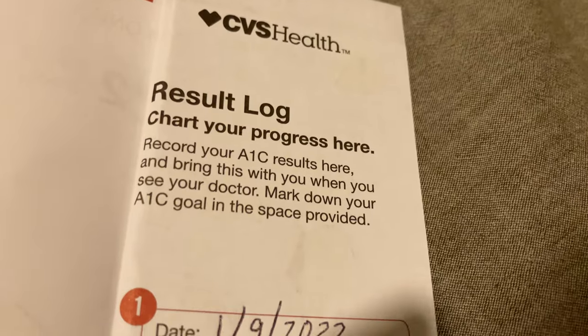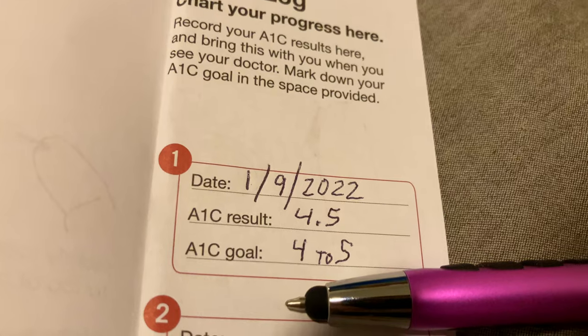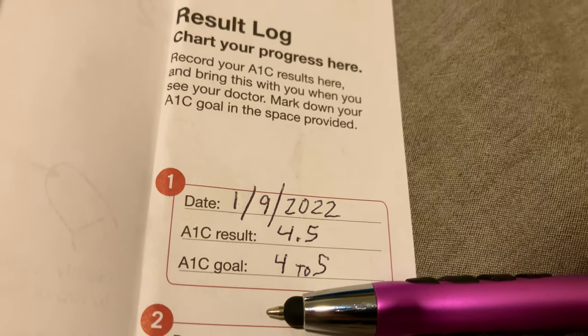Now, bonus content, you can see that I logged my data here. My goal was to have an A1C between 4 and 5, and it was 4.5, which is fun because it contains both numbers.